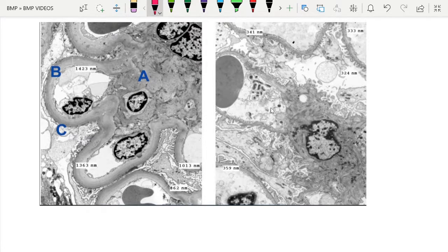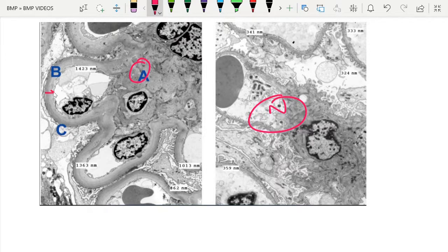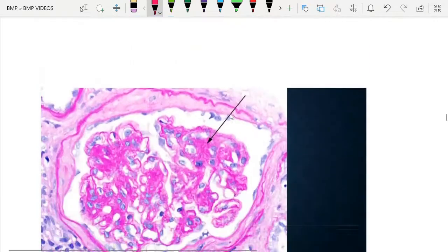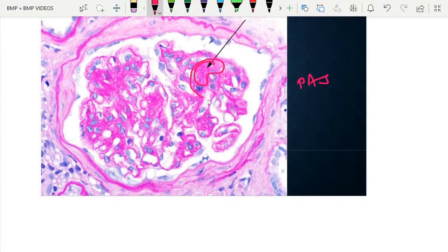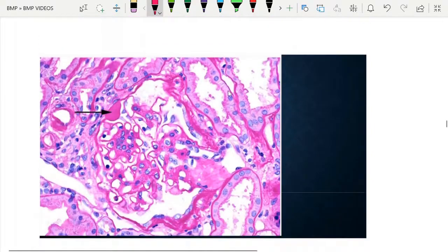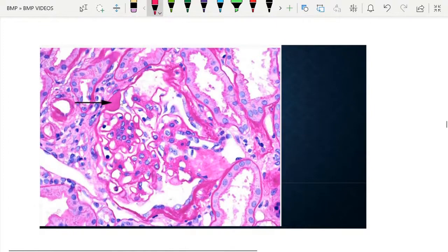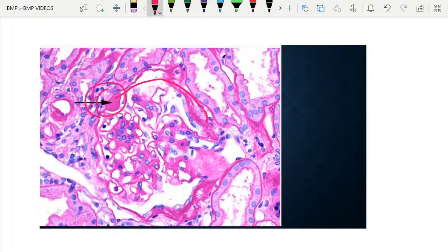This electron microscopy image of a normal kidney is shown alongside one demonstrating mesangial matrix expansion, GBM thickening, and podocyte foot process loss. Another EM image shows early mesangial matrix expansion where the mesangium is getting expanded. Additionally, there is hyaline material accumulation in Bowman's capsule — this is the capsular drop.